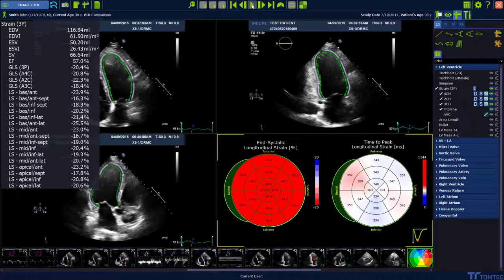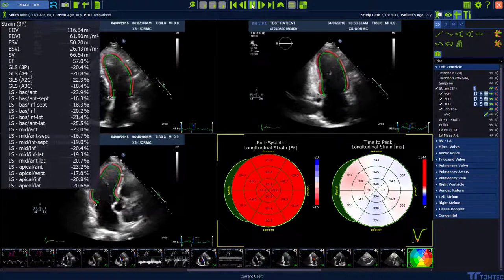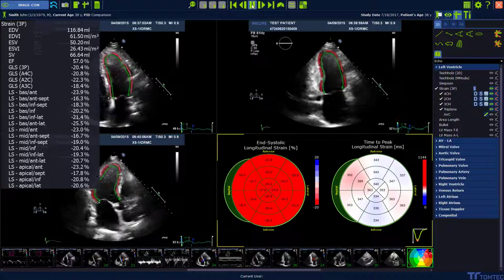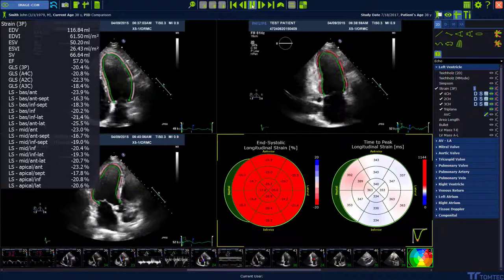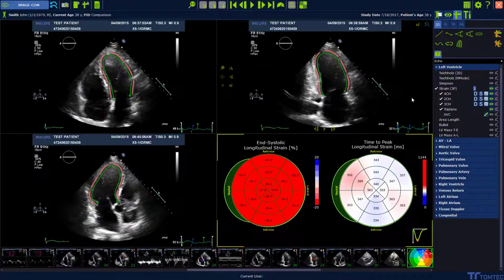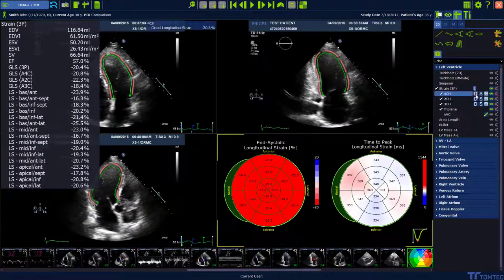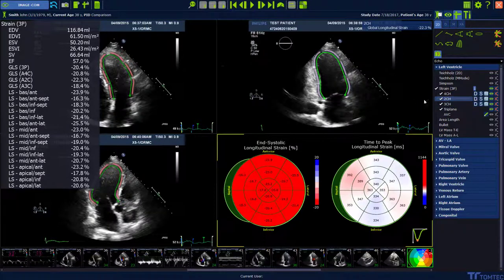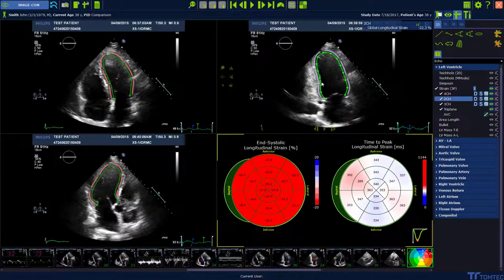Press the play button to visualize the tracking. The contour can be adjusted in end-diastole and in end-systole. Press the D or S button to jump directly to the right phase where you can perform your adjustments.